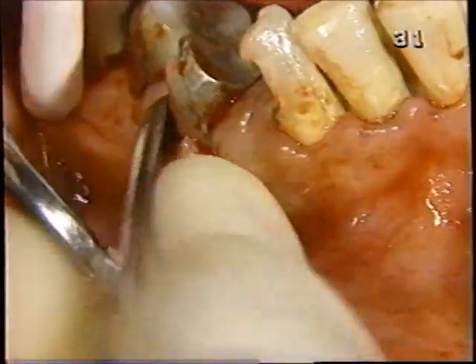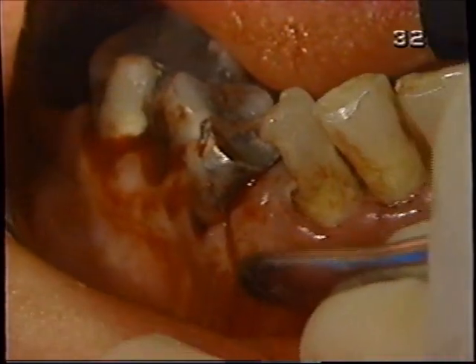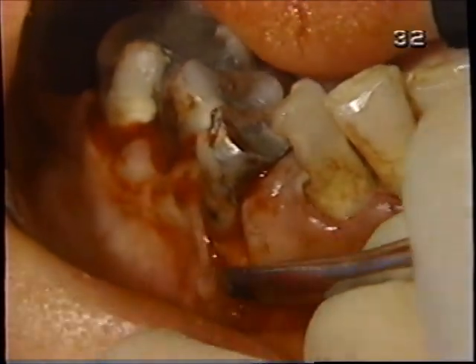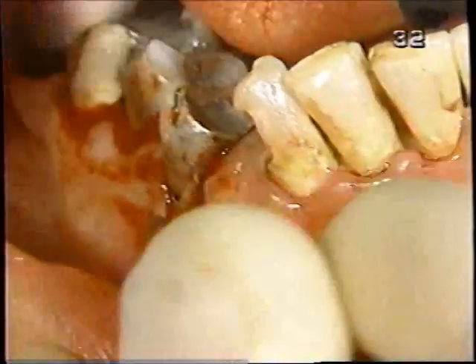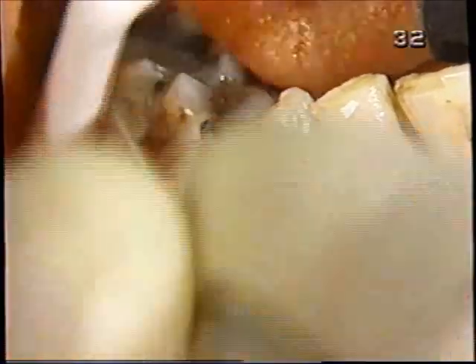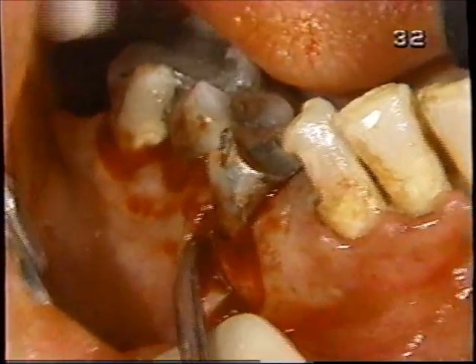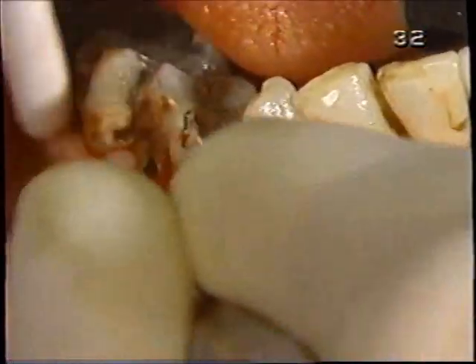Now with the sharp periosteal elevator, we won't make an incision with the scalpel along these teeth, but rather reflect with the periosteal elevator, in this case a Molt number 9. This is very thin and friable right here where the incision is, so we need to be careful. As everyone knows, we do have a mental foramen and mental nerve emerging somewhere near the apices of these bicuspids, so we're going to be careful of that area as well.